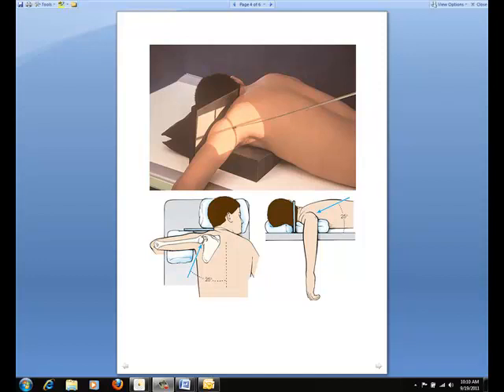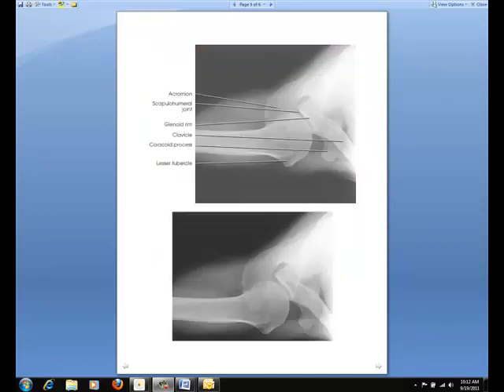This inferior-superior axial projection is called the West Point method. It is very similar to the Lawrence method, except for the patient position. Abduct the arm of the affected side 90 degrees and rotate so that the forearm rests over the edge of the table or the bucky tray. Direct the central ray at a dual angle of 25 degrees anteriorly from the horizontal and 25 degrees medially. The central ray should exit the glenoid cavity.